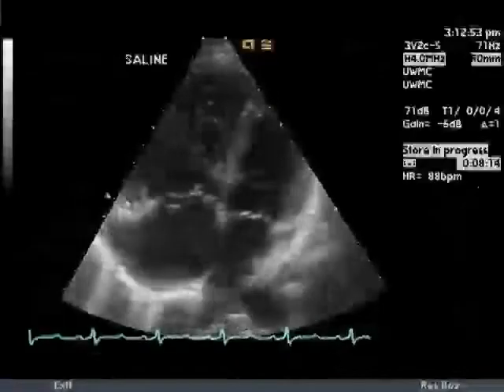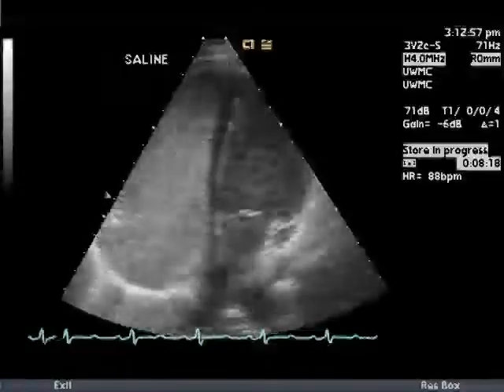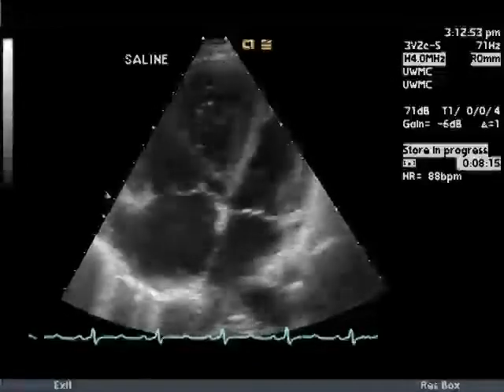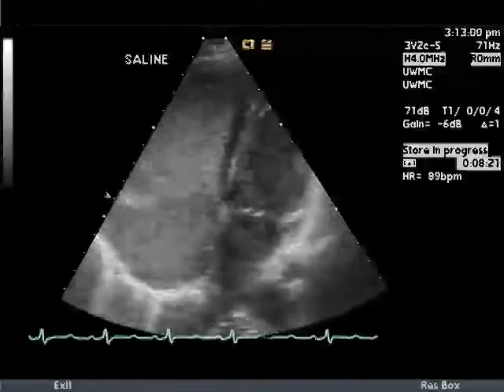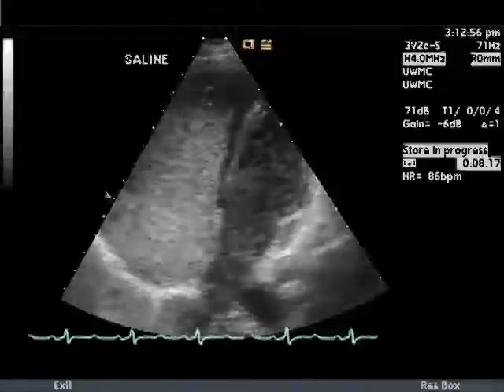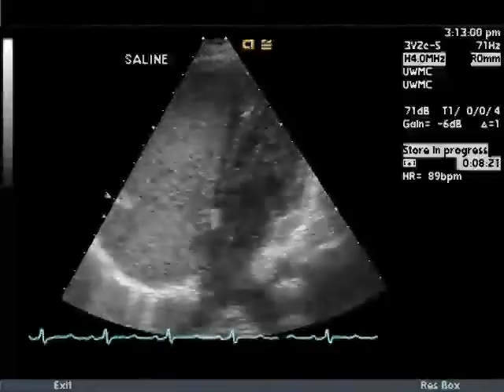When an atrial septal defect is present, a large number of microbubbles are seen in the left heart. In addition, a negative contrast jet also may be seen due to unopacified blood from the left atrium crossing the defect from left to right. Notice the right ventricular and right atrial enlargement in this patient with a secundum ASD.